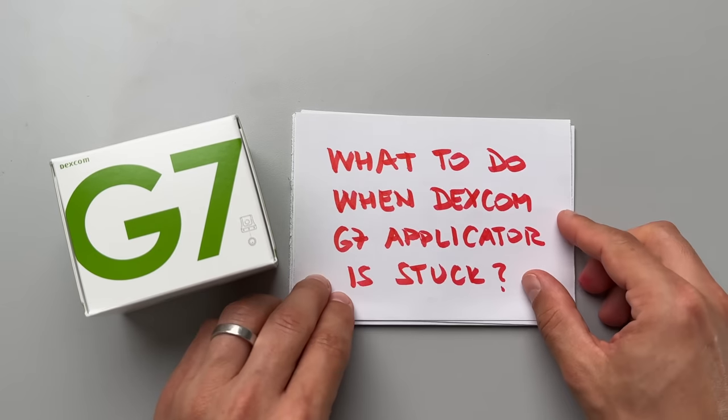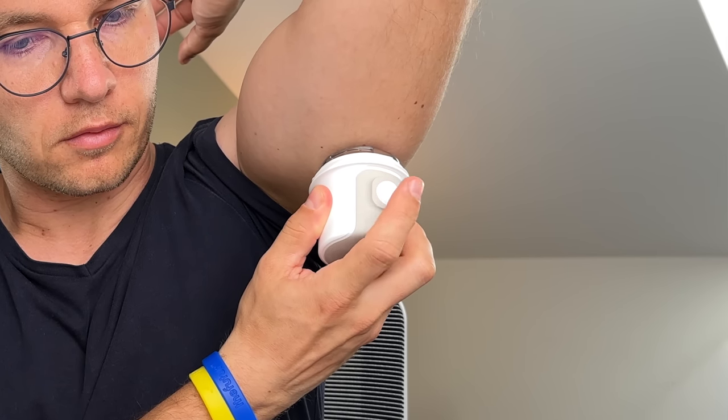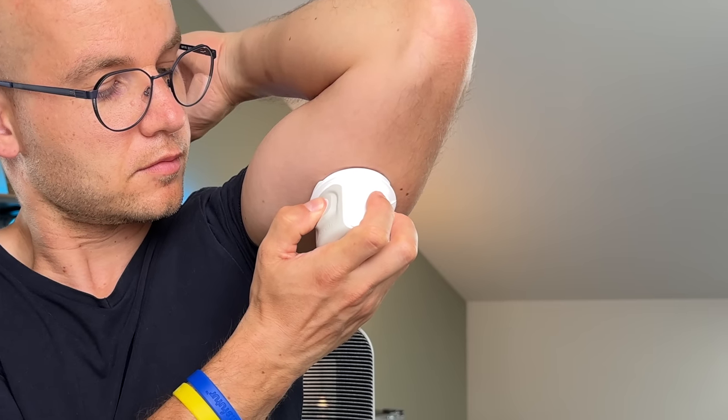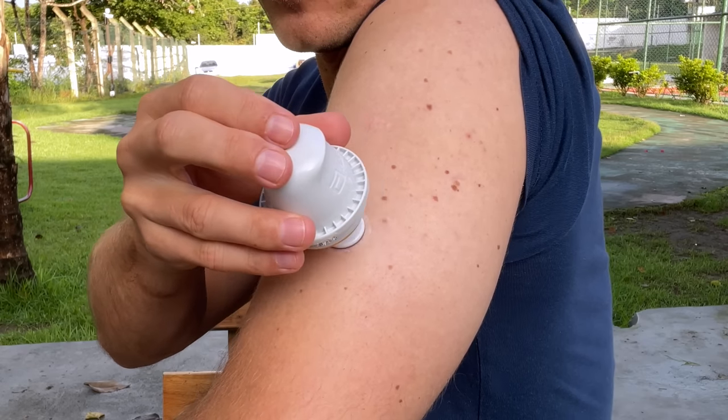Secret number 9: what to do when the Dexcom G7 applicator is stuck. After cleaning my skin with alcohol and unscrewing the cap, I tried pressing the white button and nothing happened — not with the first applicator, not with the second. Going back to the user manual, I realized I was doing it wrong: you always have to push the applicator firmly against the skin before pressing the button. Only when you push and press does the sensor get applied. I had forgotten because with Freestyle Libre sensors you don't have to push against the skin. How embarrassing!